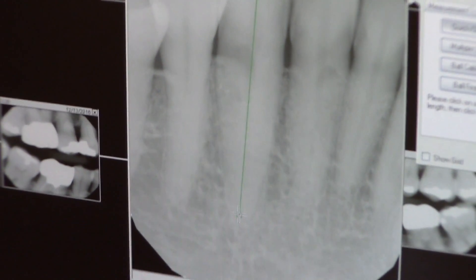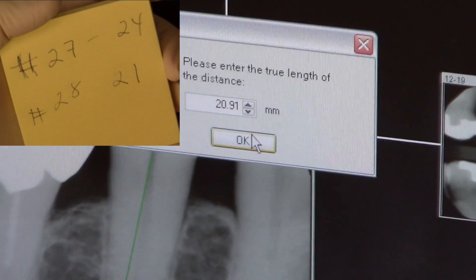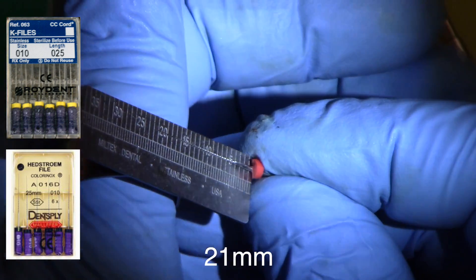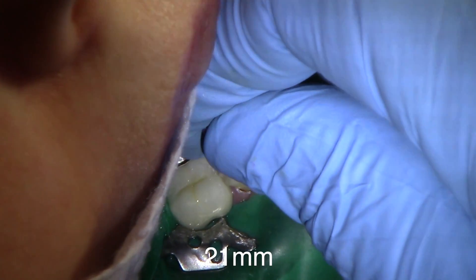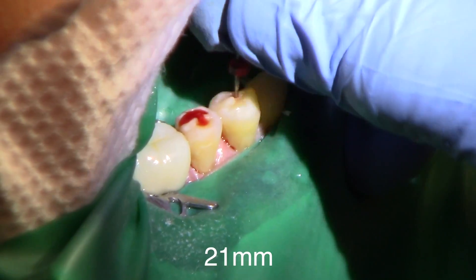You can see that tooth is about 24 millimeters long. First bicuspid is 21 millimeters long. Second bi is about the same. This is just a general idea of how long the teeth are. Then, first using the K-file and measuring 21 millimeters, which is slightly longer than we measured. Always curve the tip of the file before you put it in the canal, and then just roll it to place.